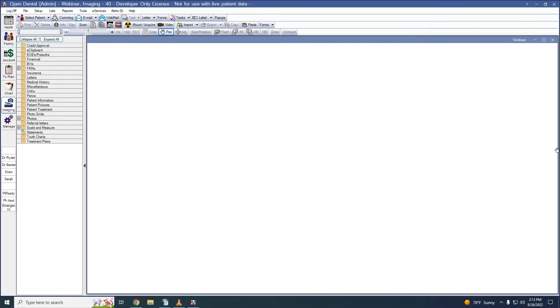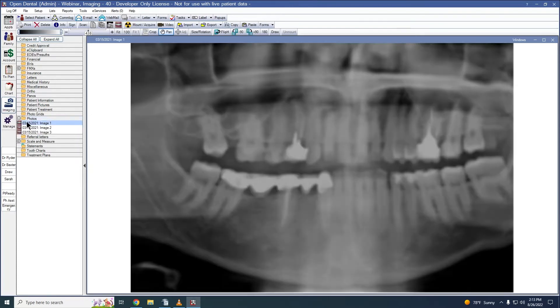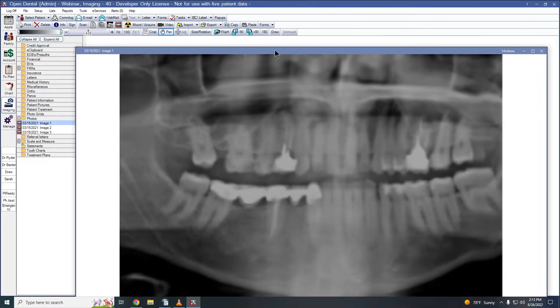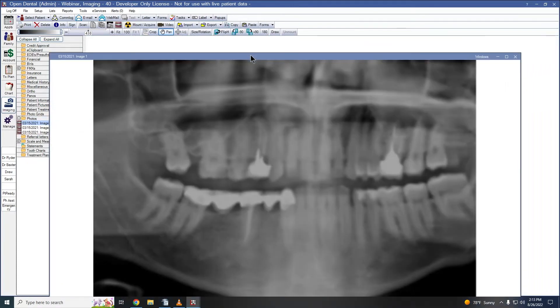First, we'll go over how to view multiple images on the screen simultaneously. To begin, select your first image, click the title bar, and drag it to the side. This undocks the image from the imaging module.